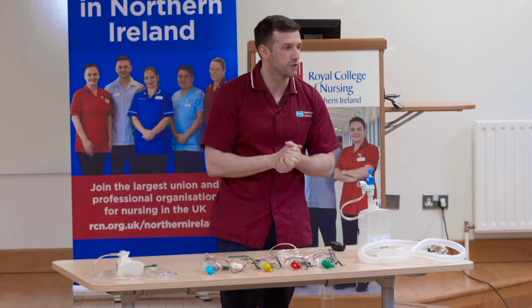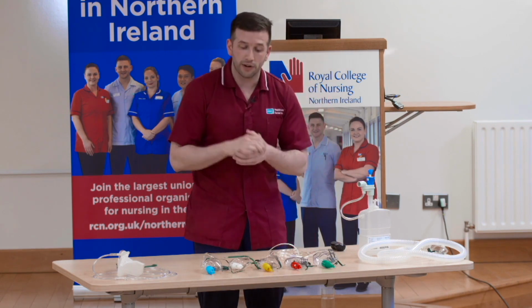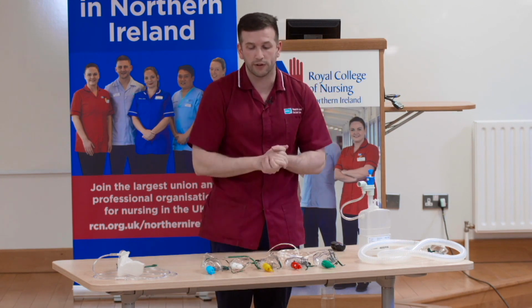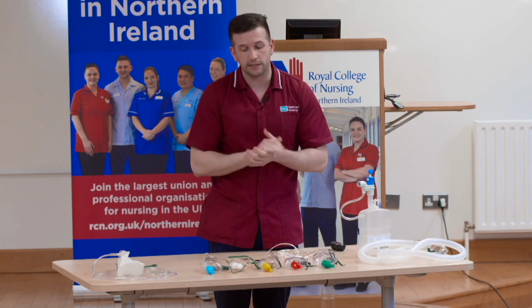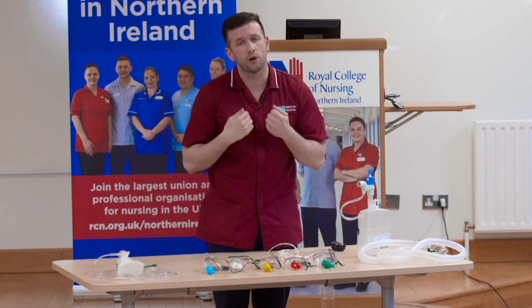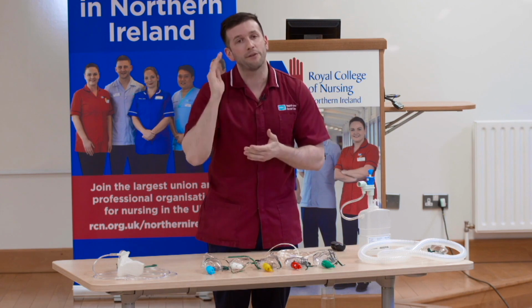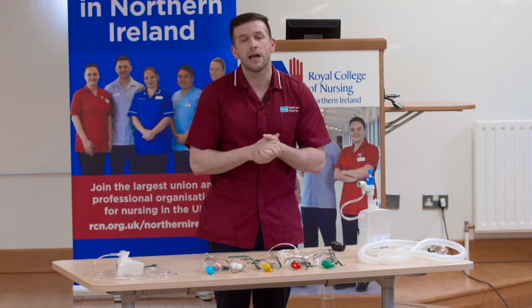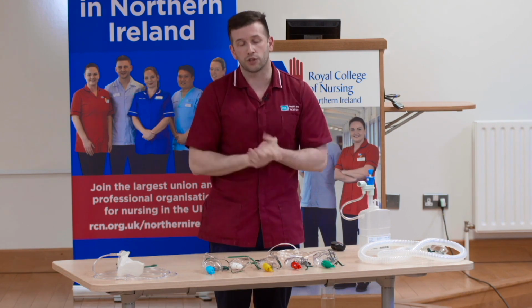Another comment on these is that if you have a hypoxic patient and you correct their oxygen saturations with the appropriate Venturi interface, even though their oxygen saturations are in the desired target range, if that individual still has an increased work of breathing or respiratory rate, you can increase the flow rate of oxygen by 50% of what the recommended initiating flow rate was, as that can in some ways help to match peak inspiratory flow and reduce the respiratory rate.